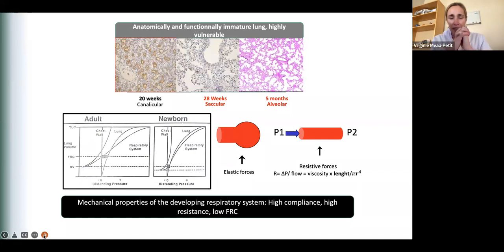And the other thing is when we ventilate, because I will do functional lung ultrasound on a patient who is ventilated, so that would be the main topic: how lung ultrasound can help us optimize the monitoring of our patient on mechanical ventilation, is to look at the changes of the lung across development.